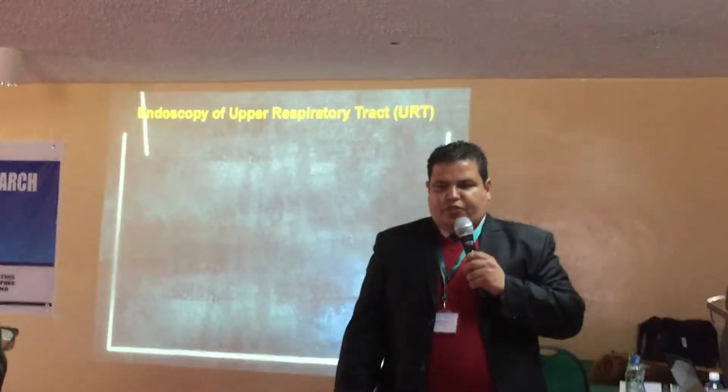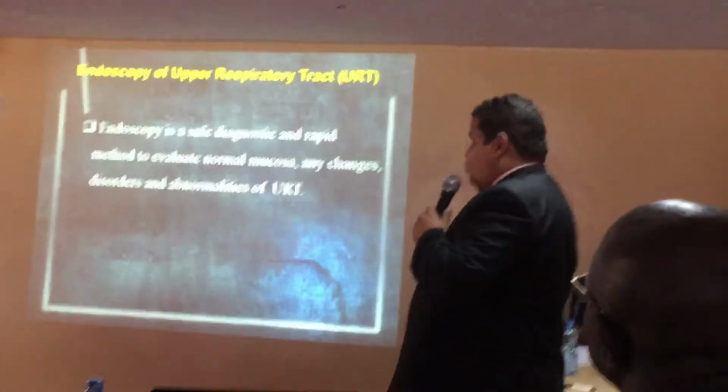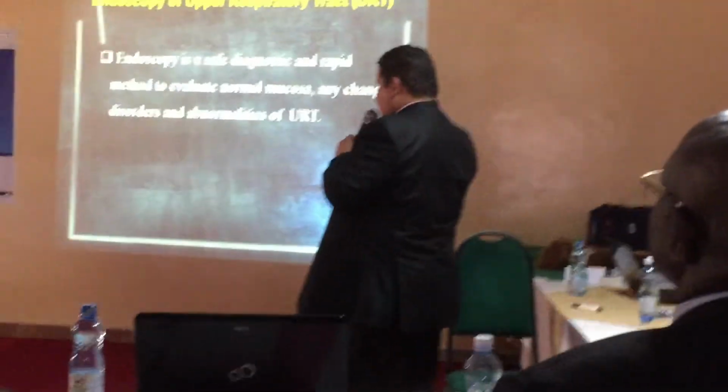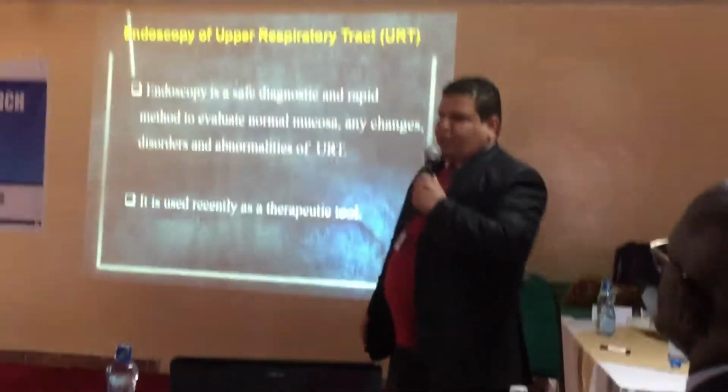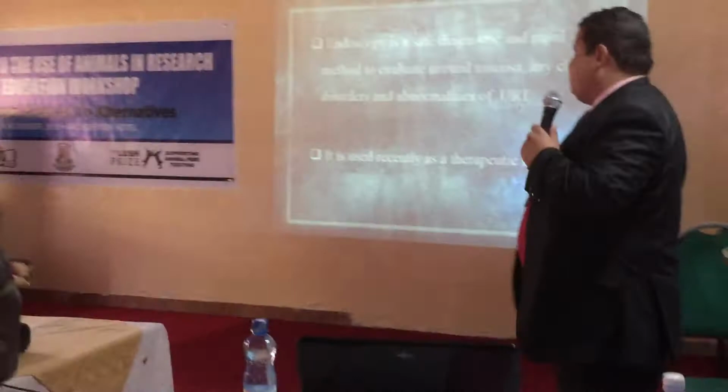Endoscopy of the upper respiratory tract. Endoscopy is a safe, rapid diagnostic method to evaluate normal mucosa, any changes, and abnormalities of the upper respiratory tract. It has recently been used as a therapeutic tool.